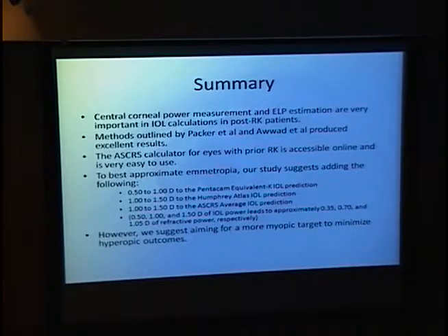Thanks, and I agree. So aiming for about minus 0.75 from our data would show that's the best chance of getting emmetropia in the near term, but like you said, I would even suggest aiming for more myopia for that.